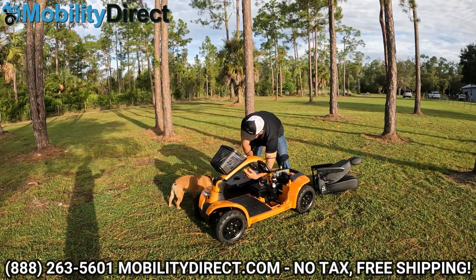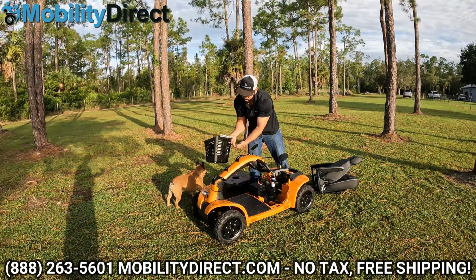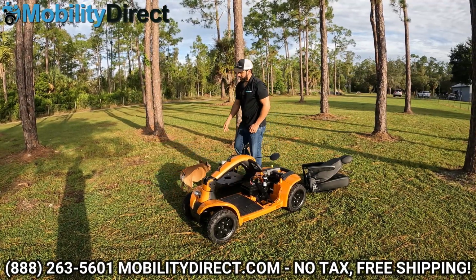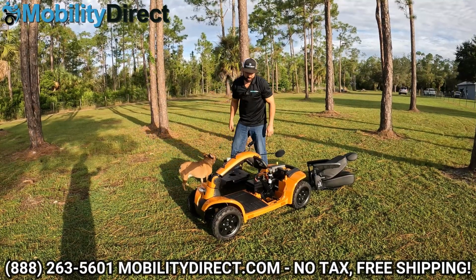Hey, Benji. Take the basket off. There's just a little clip and some hooks that slide right under there. And our Benji, it's our company mascot. Say hi to the camera, buddy. Yeah, I know. He's going to assist us.